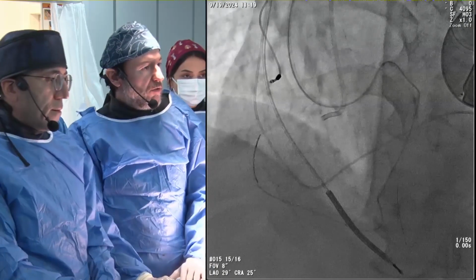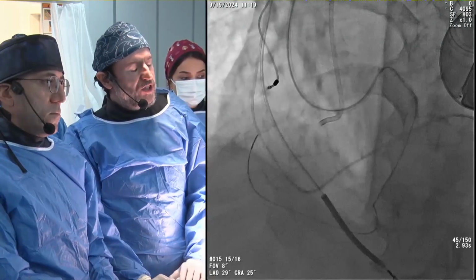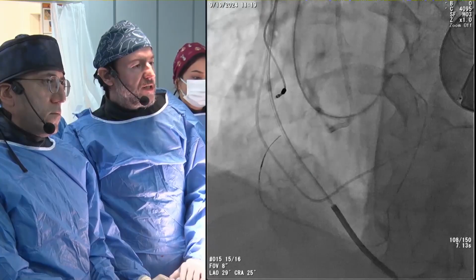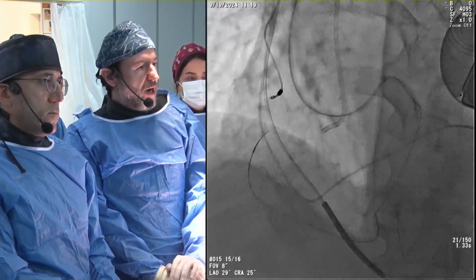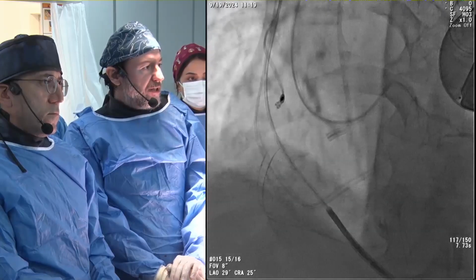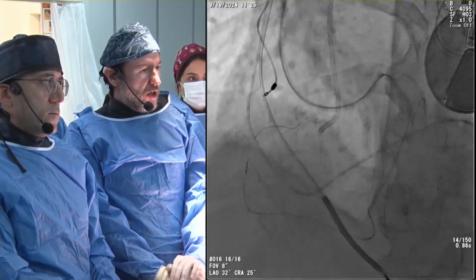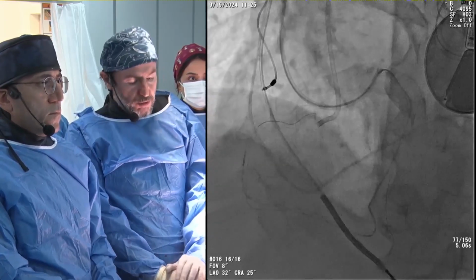So next one, we punctured first with a 3 gram any-reach polymer jacketed wire. This is like a Gladius, to give you some sense about the wire's properties. And then we changed to the Hornet 10, and the Hornet 10 went somewhere out of the vessel structure. And if you can help me from this part of the procedure, I would be very happy.